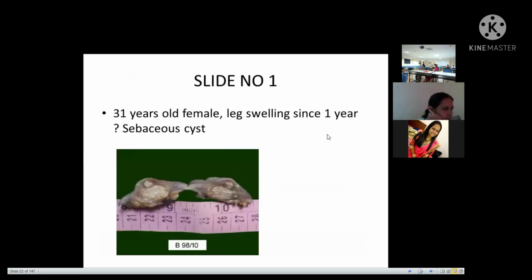So with this brief background knowledge, now let us move on to the first slide. So who is describing this slide? Good morning, ma'am. I'm Dr. Samiksha from SSIMSRC. I'm going to describe this slide.